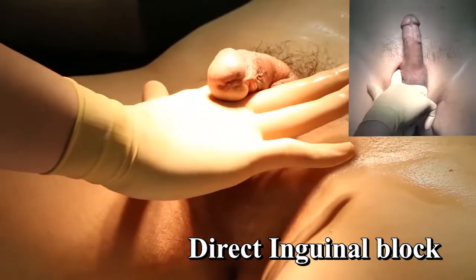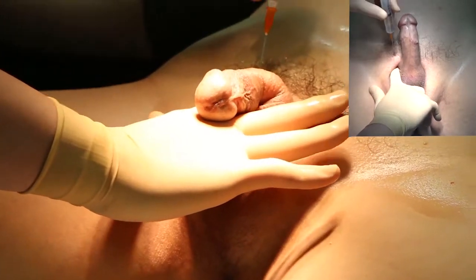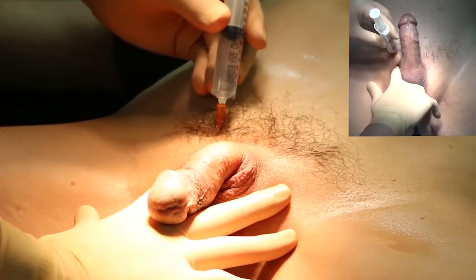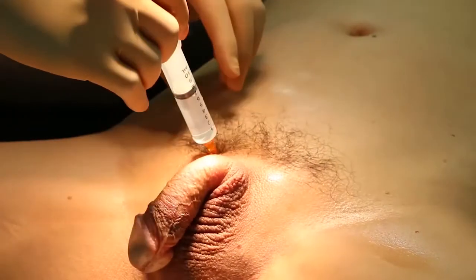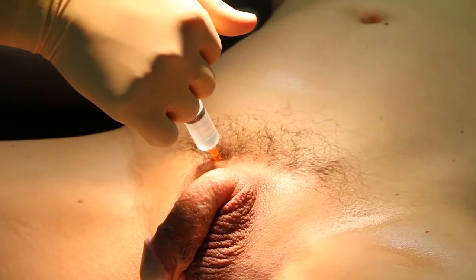To locate the external inguinal ring, the right index finger is introduced through the scrotum. After locating the canal, the needle is advanced toward the pubic bone while pulling back the index finger. After the needle hits the bone, push it with the right index finger to the inguinal ring and then inject about seven cc's.